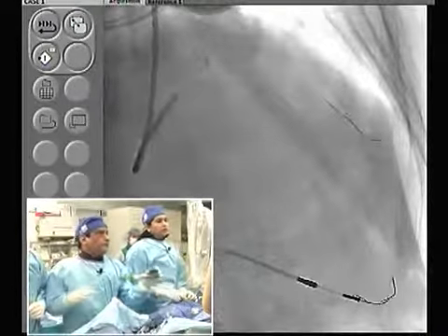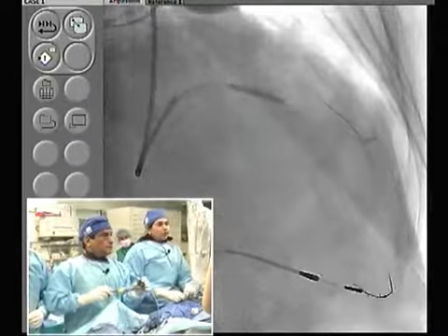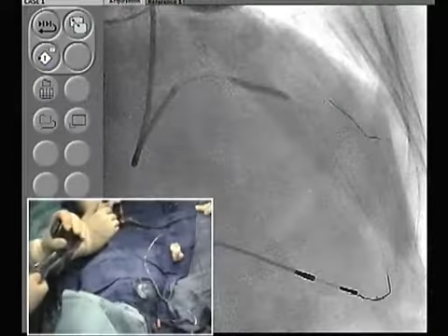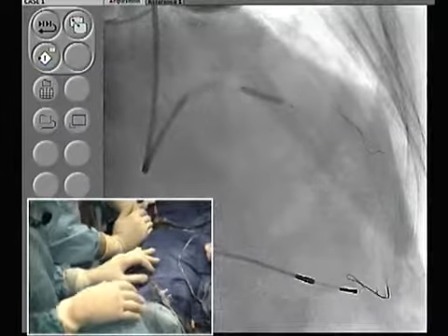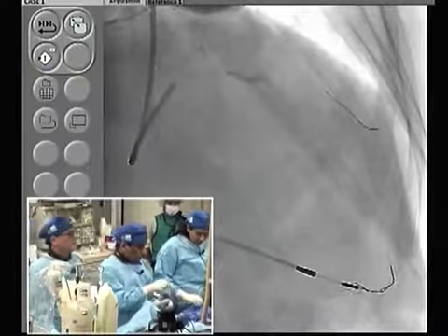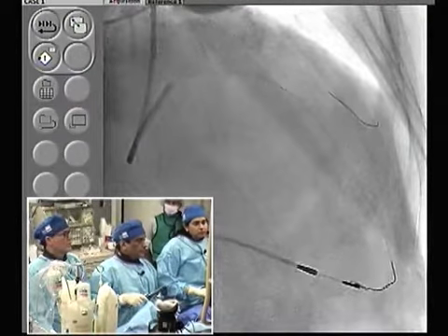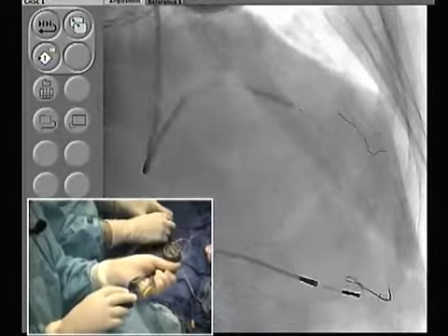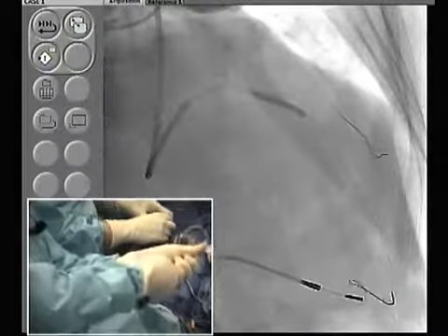Okay, so we are using a non-compliant balloon, a 3.0 by 20 Quantum Apex. The reason we want to use a non-compliant balloon is that after rotational atherectomy, knowing the calcium has been taken out, you can go high pressure to really crack the lesion. In previous cases, you mentioned that if the balloon dilates at 8 or 10 atmospheres, you feel you have ablated adequately, and the same thing happened here: at 8 atmospheres, full expansion of the balloon.